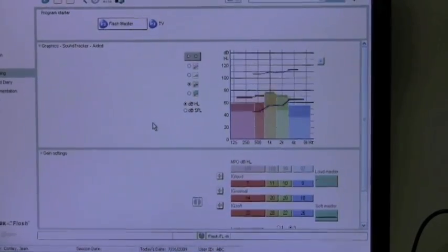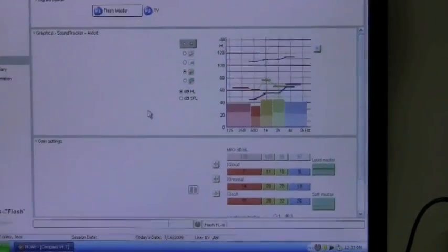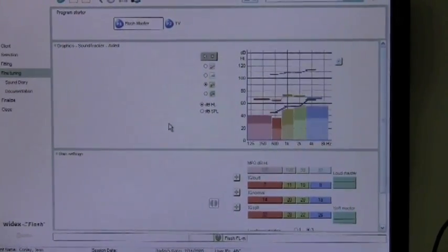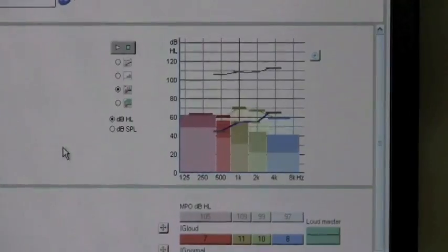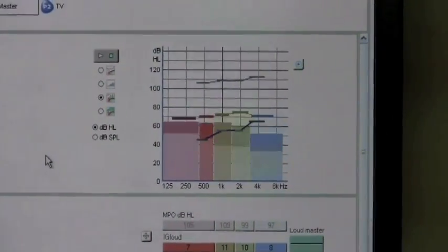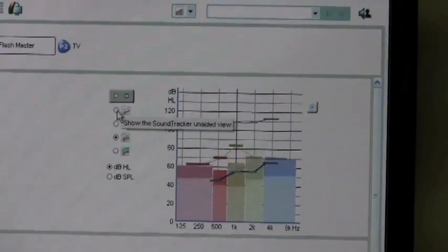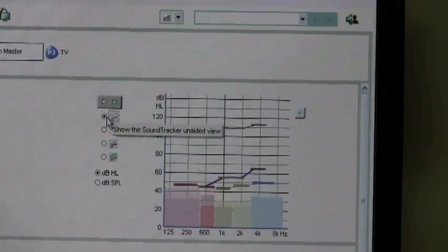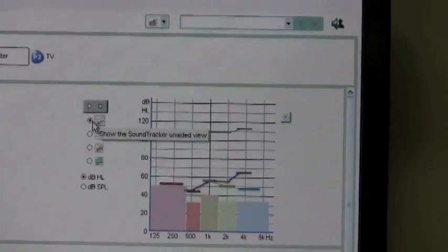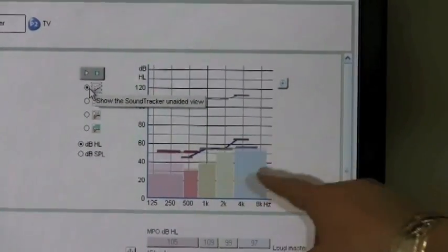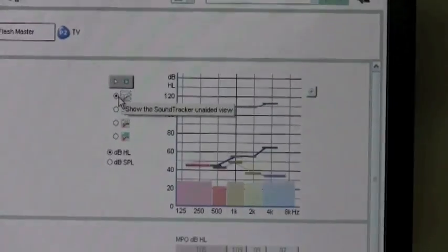And what this is doing here, it's reacting to my speech. And this hearing aid has five bands. And what we're looking at is her hearing loss. And if you look at without the hearing aids on, you'll see when I talk, it's not hitting her hearing loss. So we know that all this area here is not audible.